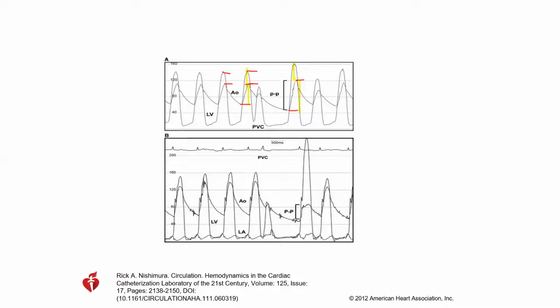But the increase in the systolic pressure has led to a prolongation in pulse pressure as compared to the preceding beats. So there is prolongation in the pulse pressure, or lengthening of the pulse pressure.